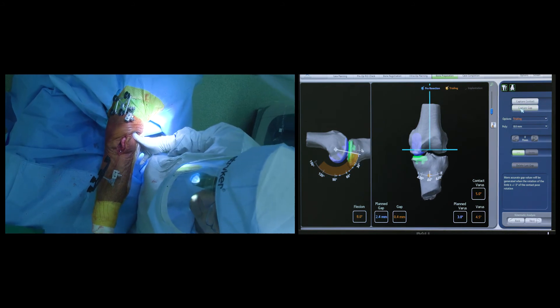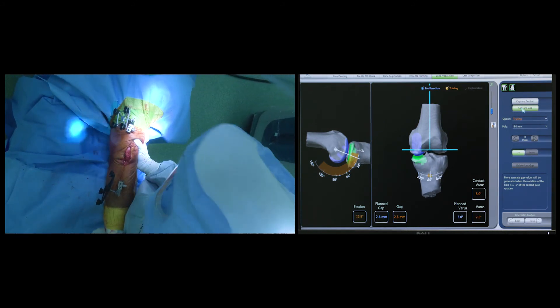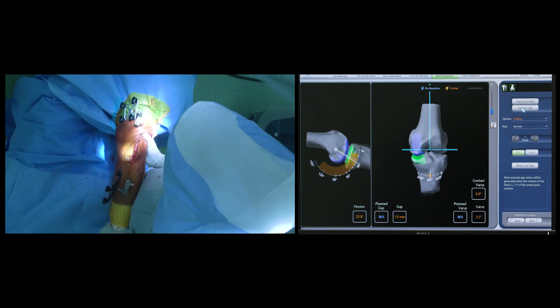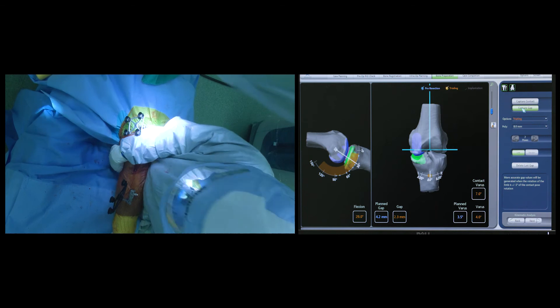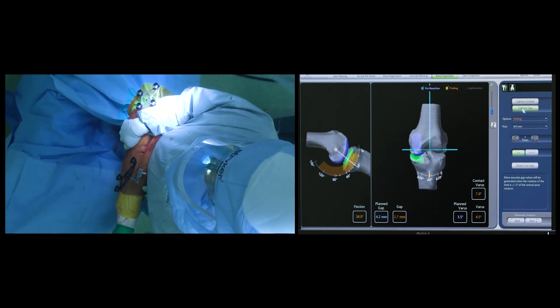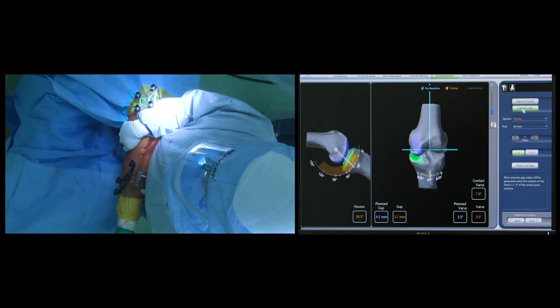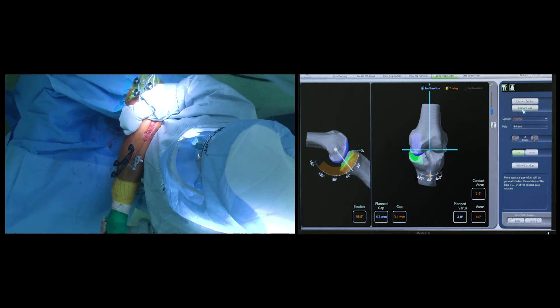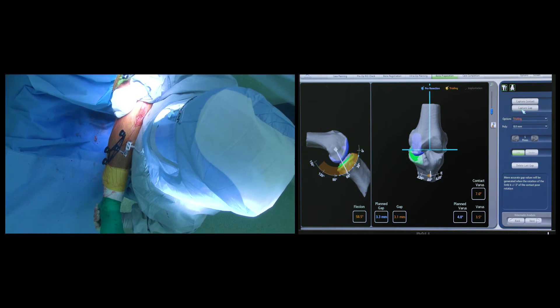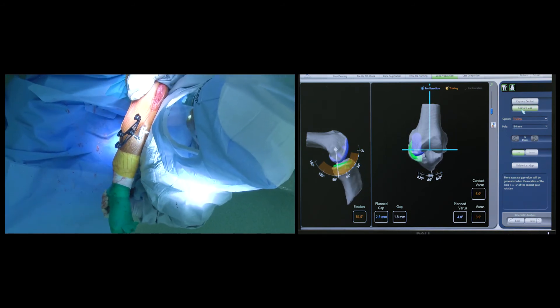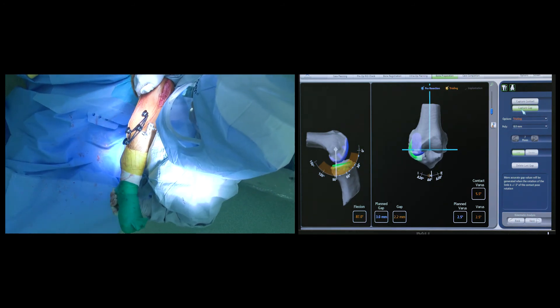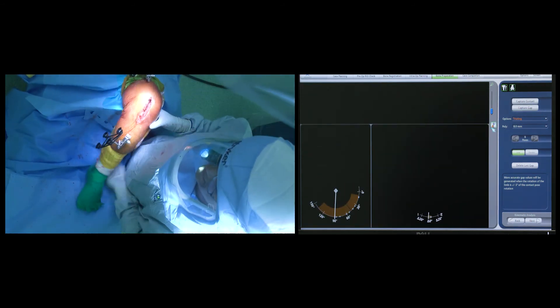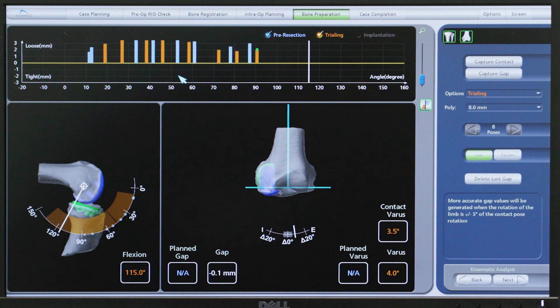Following this, the tension of the medial ligament and the opening of the medial joint line is checked one last time and allows the surgeon to make any final adjustments if required. As we can see from these images, the blue bar graphs are the ones that we achieved earlier and the orange bar graphs are the ones achieved with the trial components in place, and there's a very close correlation between the two, which means at this stage I can safely progress the operation without any further changes needing to be made.